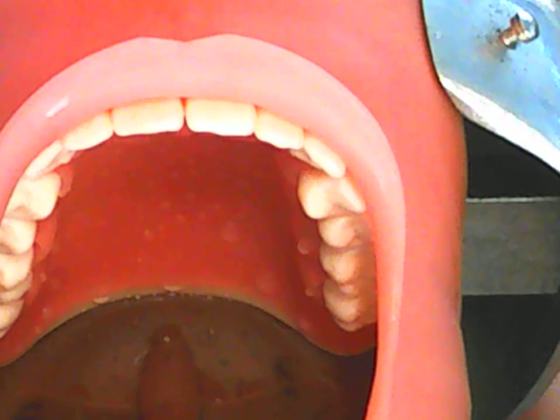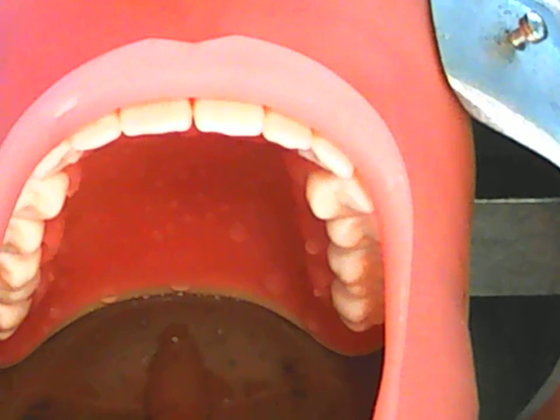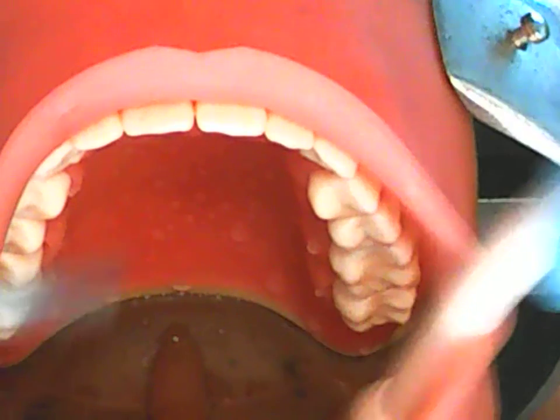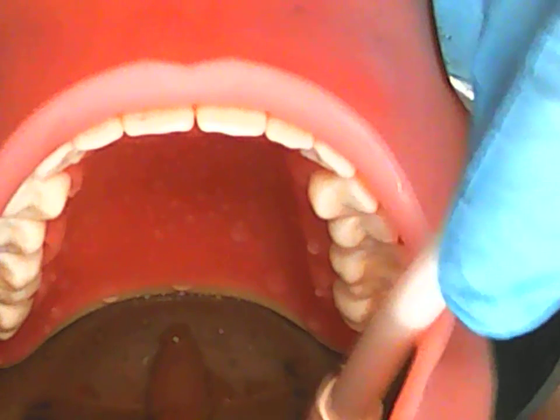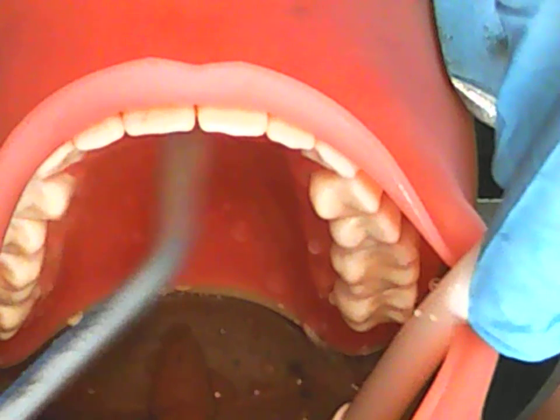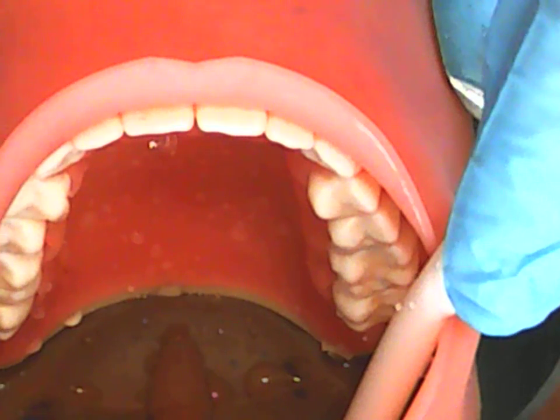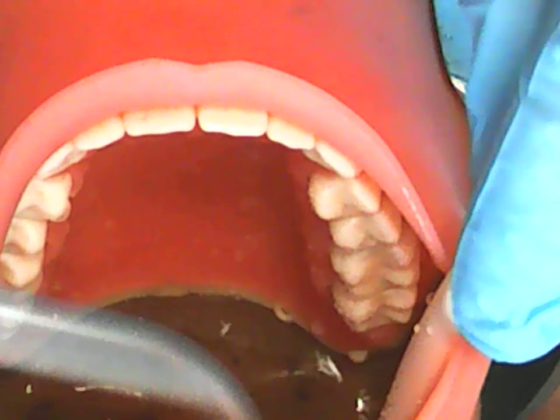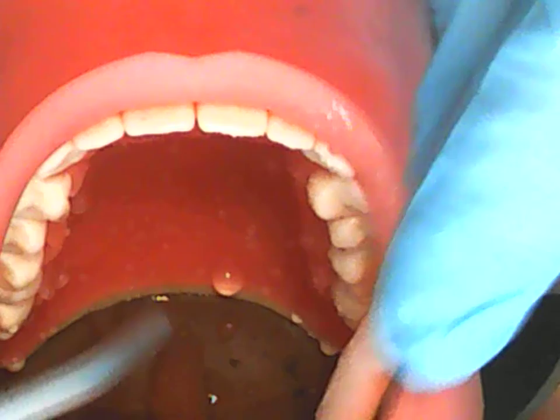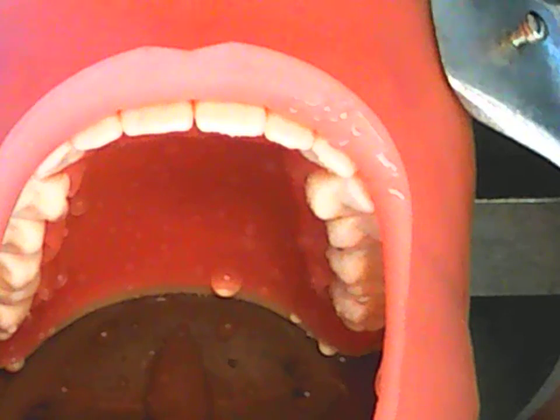Okay. Tend to your client first and foremost by providing a full mouth rinse using the saliva ejector. Okay. Again, an air water syringe in your dominant hand, saliva ejector in your non-dominant hand, and from one side over to the other, doing the buccal surface and then over to the lingual. Okay, and then even onto the mandibular, even when you're working in that area. And sometimes you might want to use water and air just to freshen up the entire area. Good. Now you know your client is comfortable.